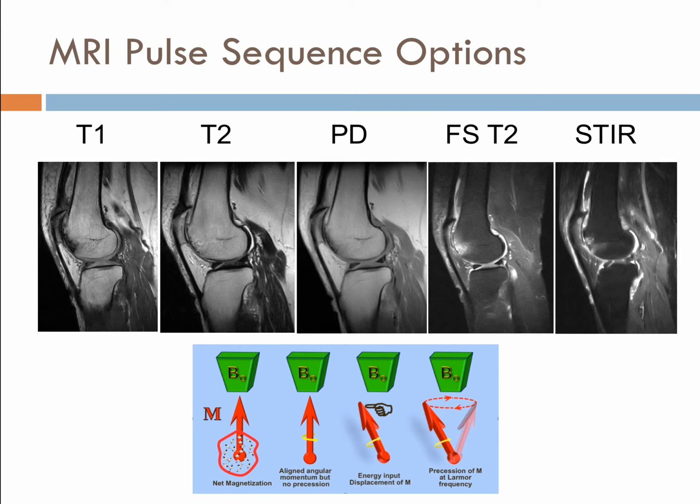And what happens when your hydrogen protons spin around and are flicked over with the application of an RF pulse and relax back, they'll give off signals. If the hydrogen proton is associated with carbon, it's fat, and with oxygen, it's water. And those two, fat and water, because of their different hydrogen linking properties, will give off different signals. So we're able to alter those signals and give different imaging characteristics, or different qualities to those imaging characteristics. And that's what I've shown up on the screen.